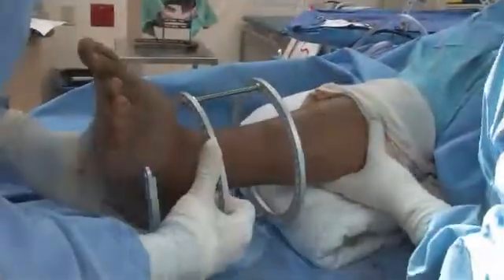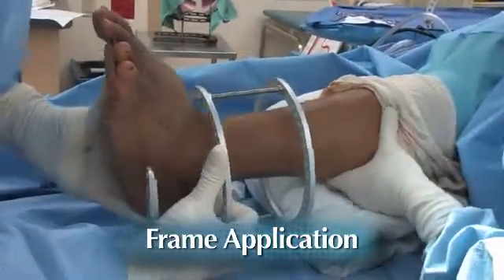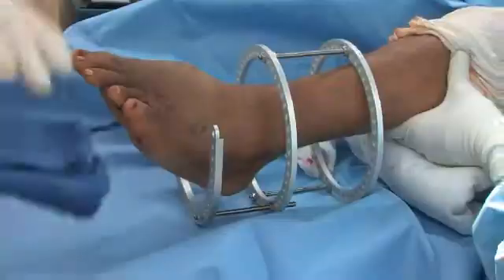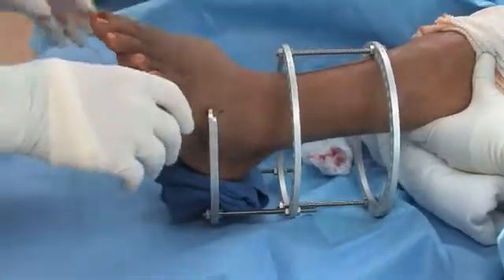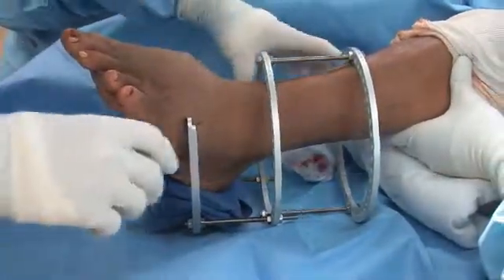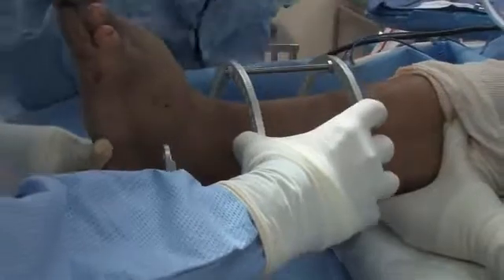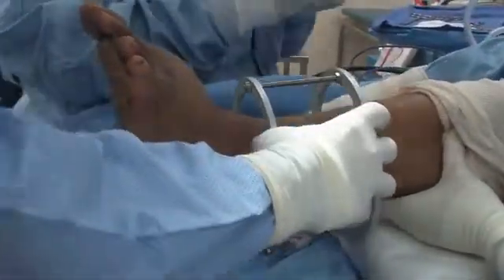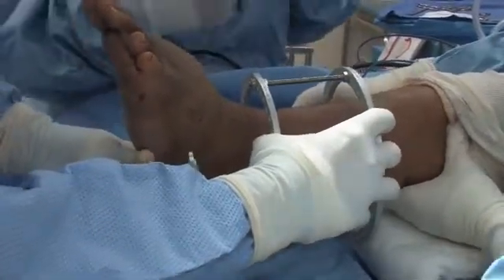So the position of this, I want to make sure the tibial ring block stays in the tibia and doesn't come into the ankle. I just put a reminder towel behind the heel on the foot plate just to make sure we don't have the heel up against the foot plate there. So the foot plate will be midline to the calcaneus. The tibial ring block is going to be aligned with the anterior tibial crest, and the alignment looks pretty good right there. So I'll have my assistant hold the leg.